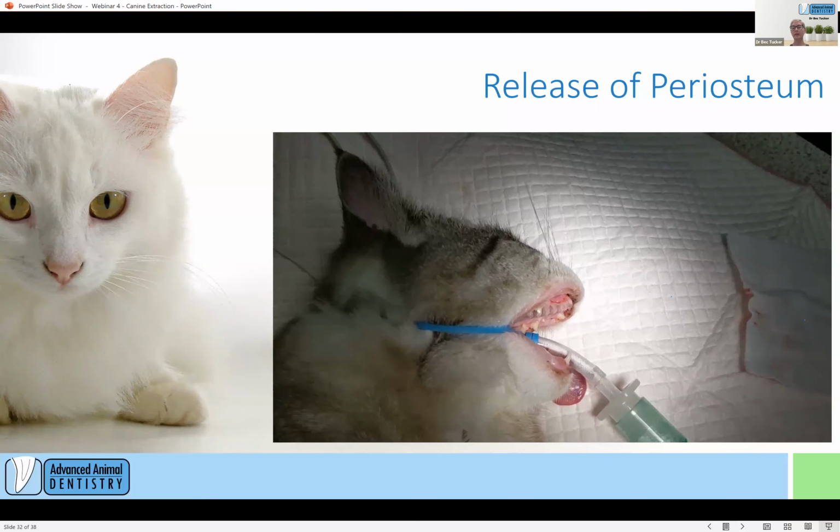I think there was possibly a lot of focus on how atraumatic it was. And yeah, it can absolutely be. But I still experienced a few negative effects from it. And I still think that, if you're using it, fantastic, it works well in your hands. But for canines especially, you still want to close these as well. There was a little bit of thought going around and some people advocating that you didn't have to then do surgery to close these extraction sites, and generally I'd argue that.